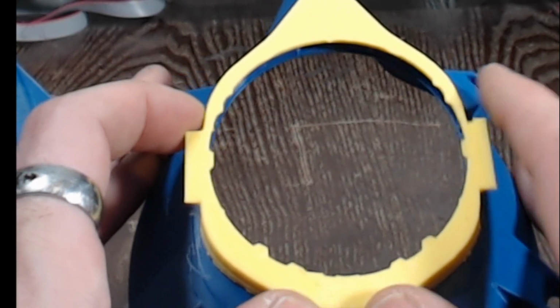So this was my first attempt at a cover, and this one as well, the horizontal expansion was off on both of these models. So we did a little bit of adjusting, and after that, the parts fit perfectly, and everything's a lot more solid now. As you can see, there is a large difference in thickness.